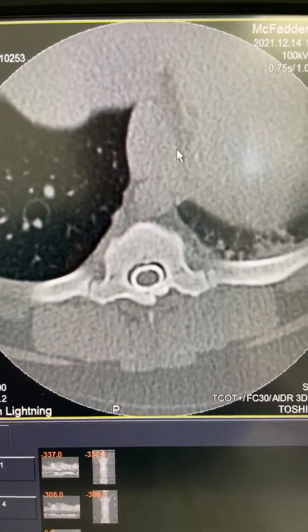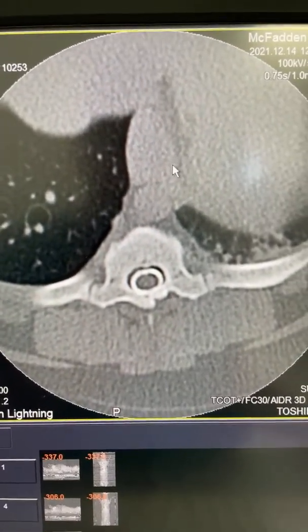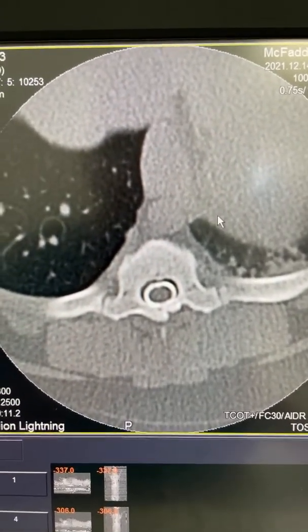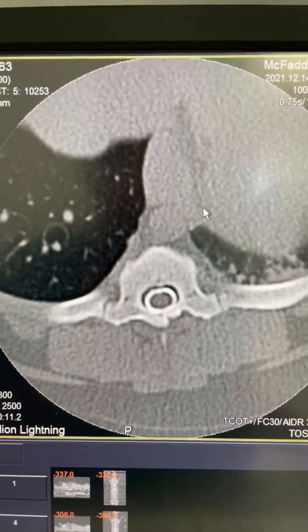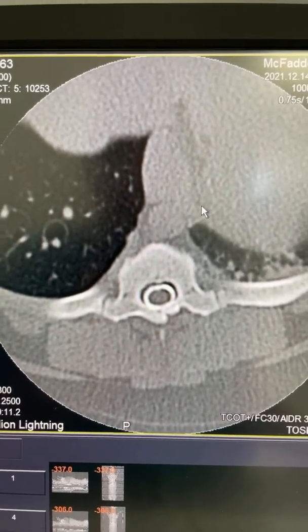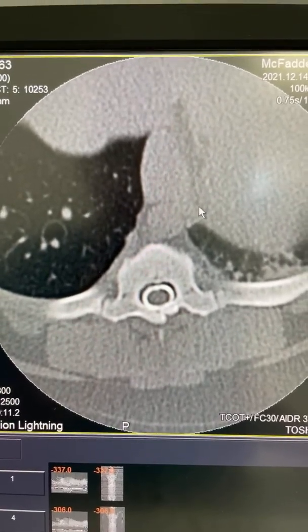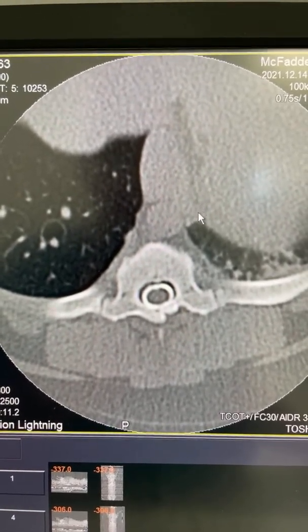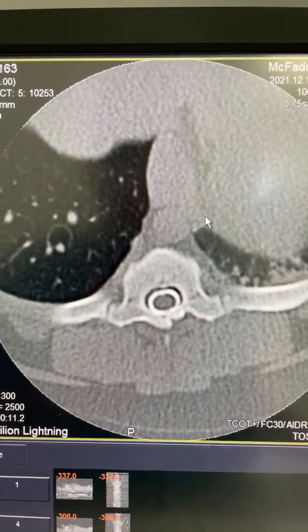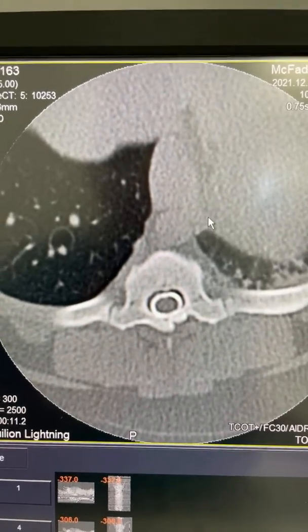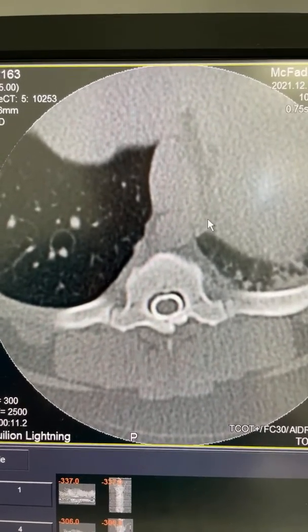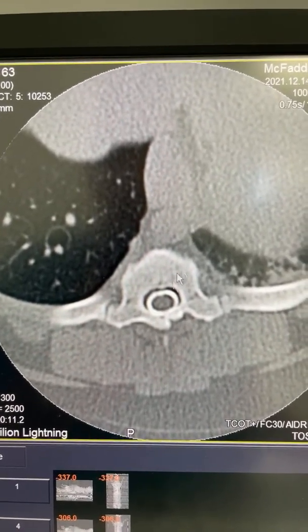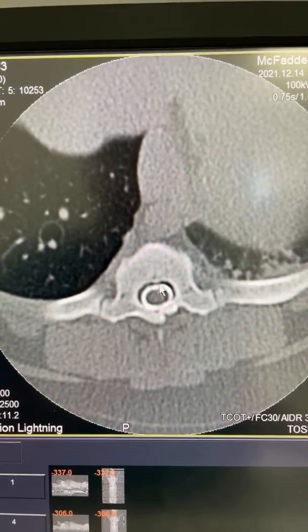Hi guys, this is Charles. I'm one of the surgeons at Southpaws and I've just done a myelogram for you on a live video short story, and I was just showing you the post-myelogram CT scan to see what it looks like with the contrast in place.